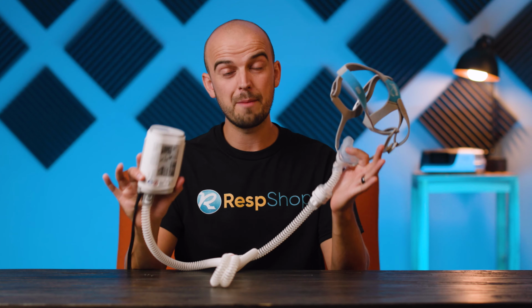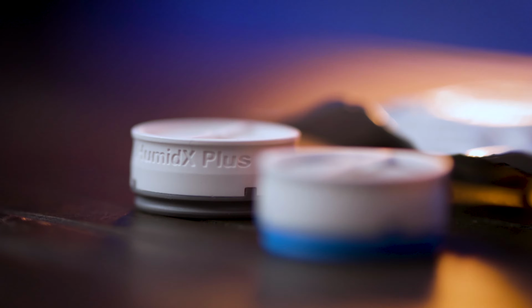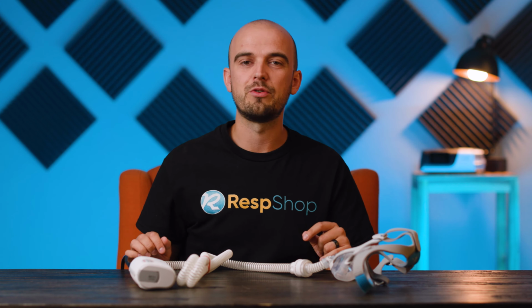So today, we're going to put those tips to the test. We're gonna run a sound test with a bare bones unit like this, which is how you would see it out of the box, and includes the HumidX filter. By the way, this is often the perpetrator, how this lets air leaks out of it. And then second, we're gonna do all the tips and see what difference they make to the overall level of noise. So as a reminder, here were the 4 tips that we covered on that previous video.